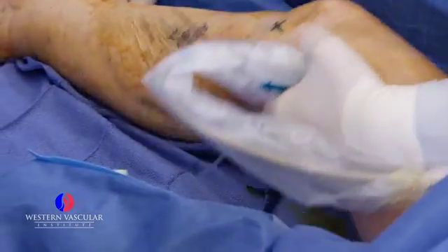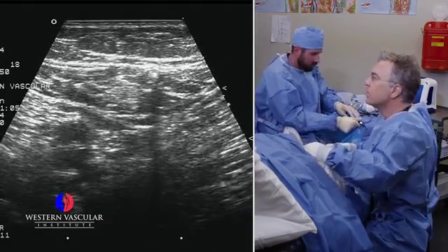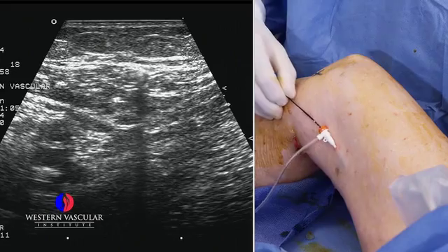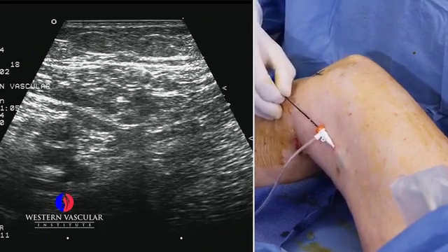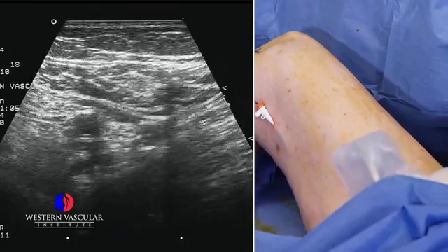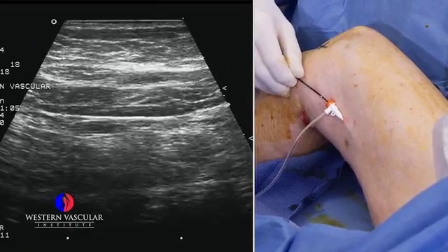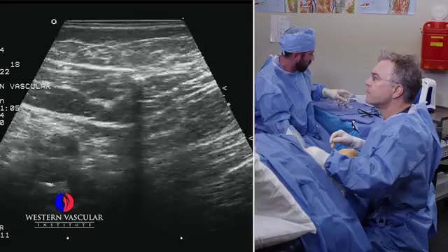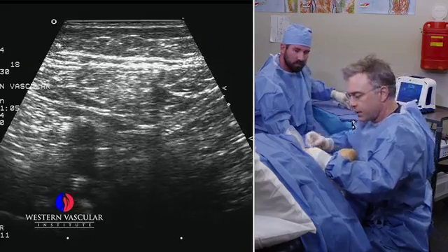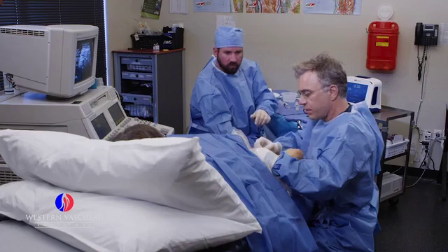We image the area that we want, going close to the groin level. What you see on the screen is a dot moving — that's the catheter — and there's a black line, which we call a posterior shadow, around the area where we want to position the catheter. To the left, where you see me pressing, that's the deep vein structure — we definitely want to stay away from there. We position the ablation catheter a safe distance away from the deep vein. Then we start numbing up this area with a tumescent solution, which is basically a lidocaine or novocaine mixture with a little bit of epinephrine and saline, to protect the tissues and nerves around the vein from the heat ablation.